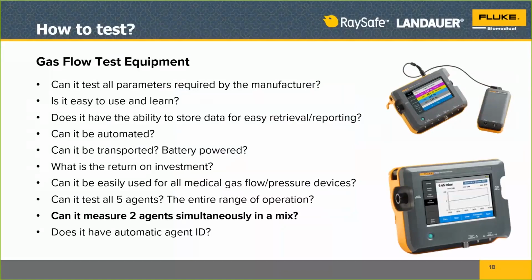Knowing what can go wrong should point you towards picking your gas flow test equipment to be able to perform the tests. You might be moving around the hospital, so you might need all-day battery life. You might want onboard memory to be able to test at multiple sites and come back at the end of the day and download your test results. You might need to test anesthesia machines, right? It's probably why you're listening here. So you probably need ultra-low flow and ultra-low pressure.